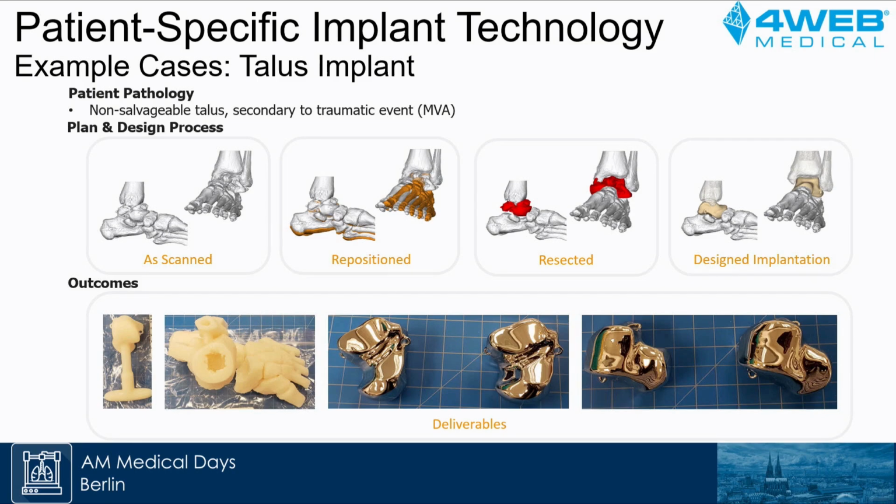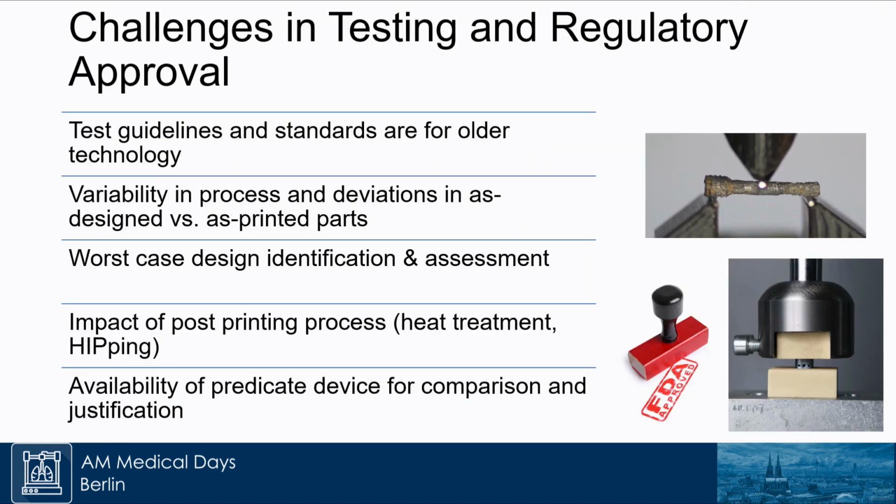The reason that we use cobalt chromium is because it's very important to have a very polished surface to avoid damaging the tissues and the cartilage at the joint, at the ankle joint. In a previous conference, I've seen some examples of titanium implants which had some polished surfaces, but I don't think it comes anywhere close to what you get from cobalt chromium. So that's another good application.